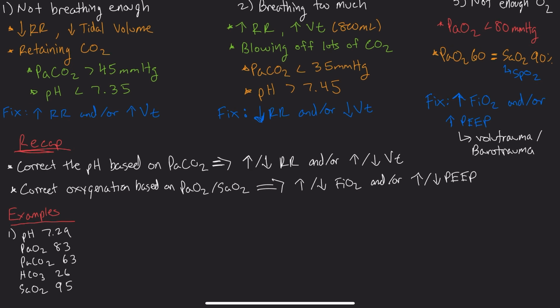If you're looking at this, you can see that the PaO2 is within normal range, 80 to 100. This is within normal range, 22 to 26. And the SaO2, 95 to 100, is also within normal range. So you have 2 values here that are outside of your normal range, right? And once again, we know that with an elevated PaCO2, you're going to have a decreased or an acidotic pH, right? So we know that because it's the PaCO2 that's out of normal range, we know it's respiratory, and then the pH is low, so we know it's acidic, so it's respiratory acidosis.